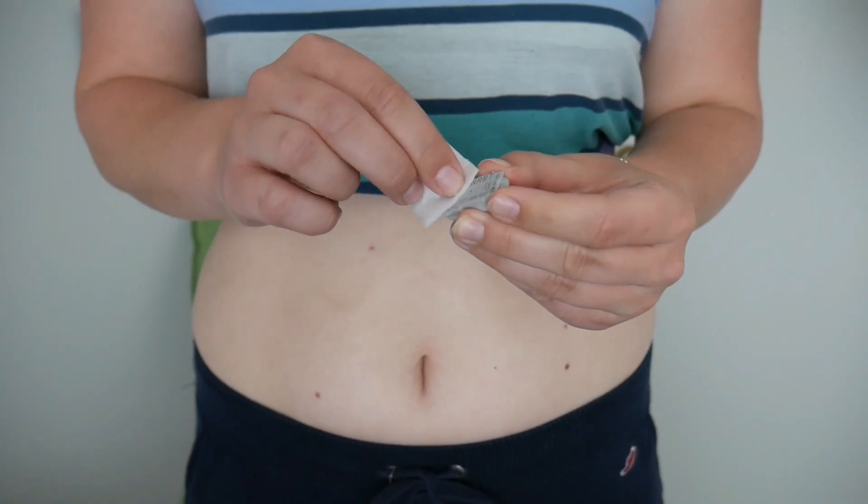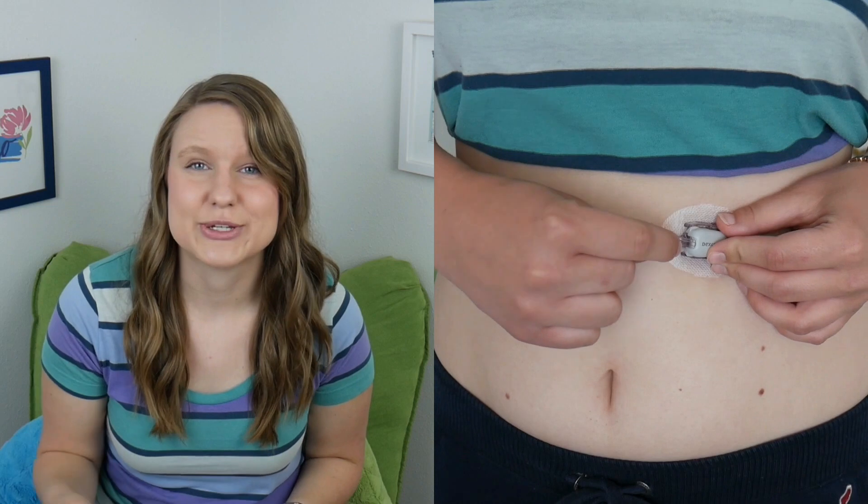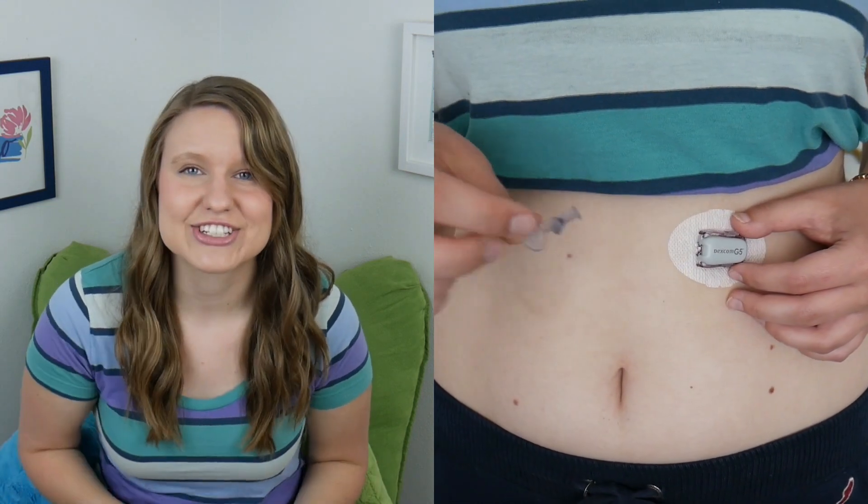Then, you are going to insert your transmitter. Clean the back of your transmitter with alcohol, and once it's dry, you're going to tuck the narrow end into the sensor pod. Move the latch forward until you hear two clicks. Then, you can just twist off the latch.